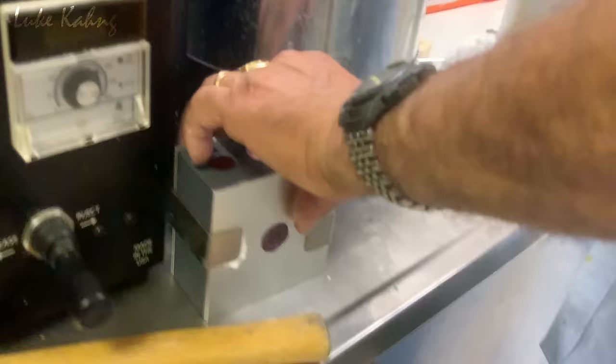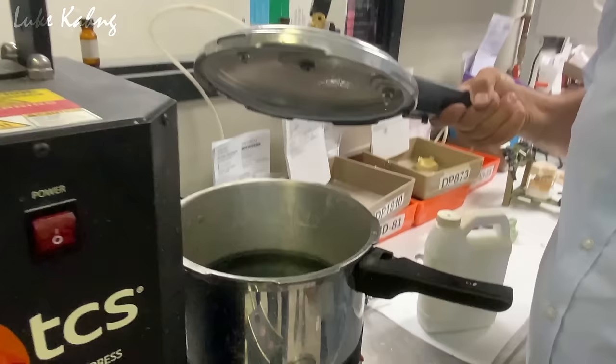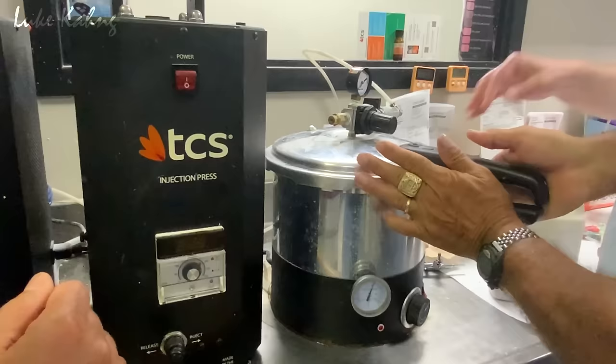And another thing you can do, give me a cap, one of these. What I like to do, because sometimes the air directly will make it flow out, so what I do is put this in, and then I'll put this cap on top of it, just to keep the air from blowing inside. Okay. There.